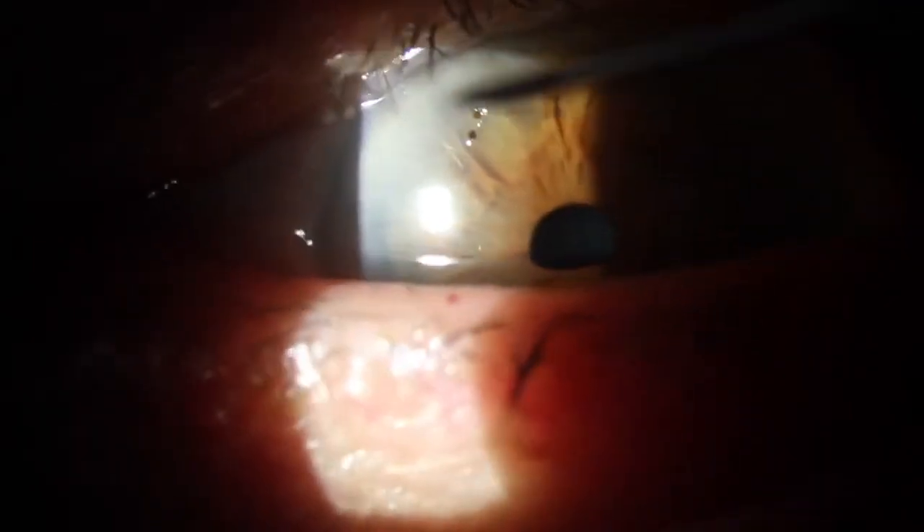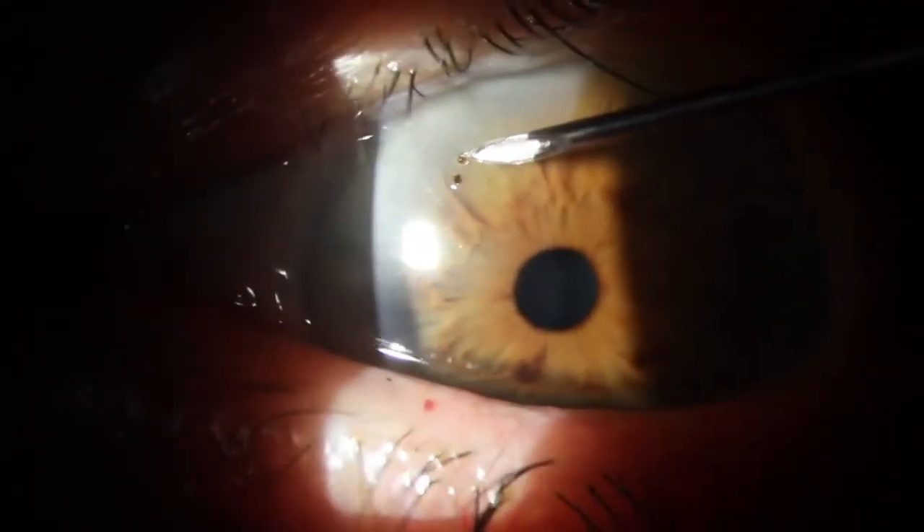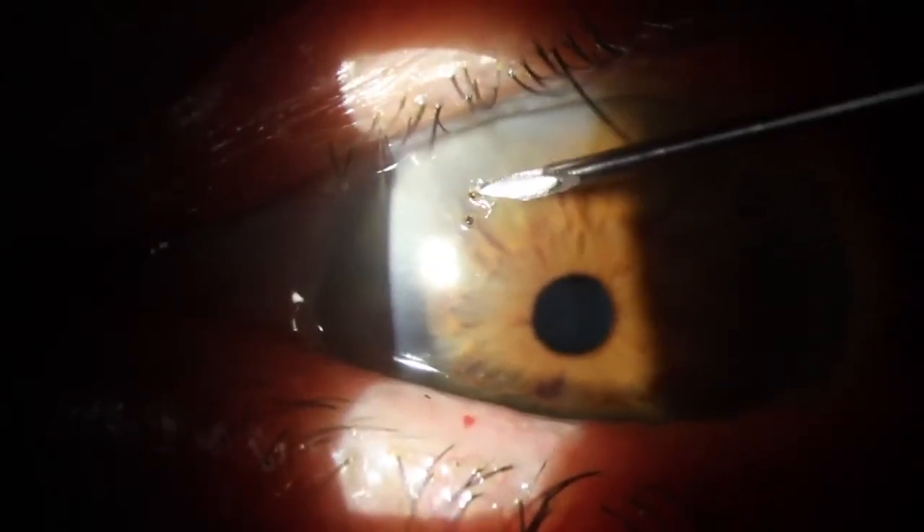It's important to have previously ruled out a penetrating injury in all of these patients. That would obviously be a significantly more invasive procedure to have removed and will often require a vitrectomy.